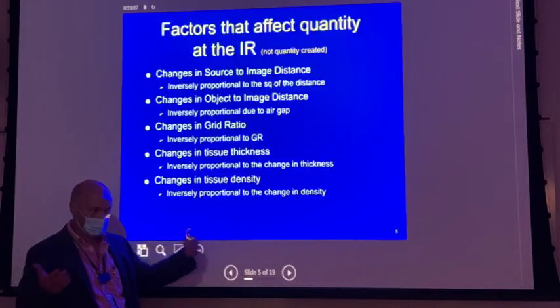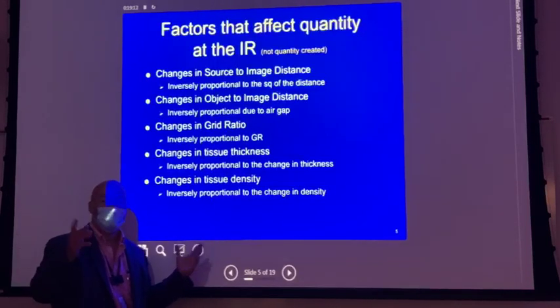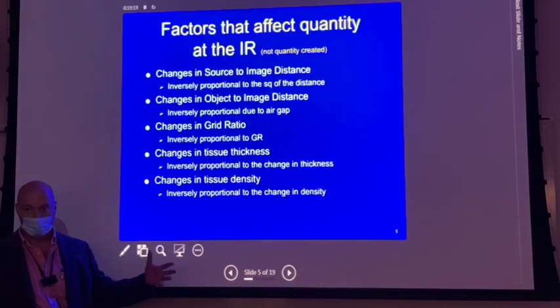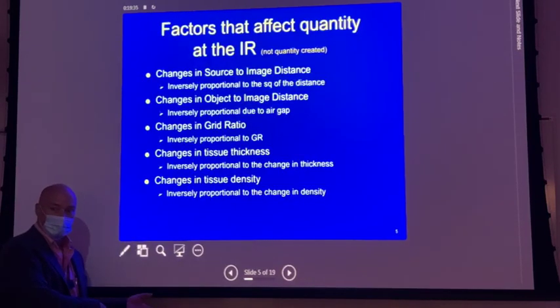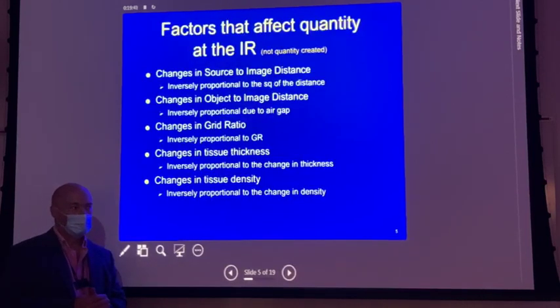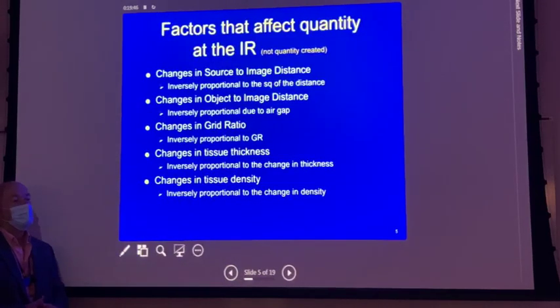Okay, so you see what I'm saying? Increase scatter, density's gonna increase? Well, not necessarily. Your density is gonna decrease if the increase in scatter is because of an increase in tissue thickness. Okay, if we're talking about a change in tissue density in the same thickness, let's say we've got a replacement of bone with soft tissue, then we very well may see an increase in radiographic density because of loss of subject density. Does that make sense? So it just depends on what changes. If it's the part thickness, then the density decreases. Write that down.